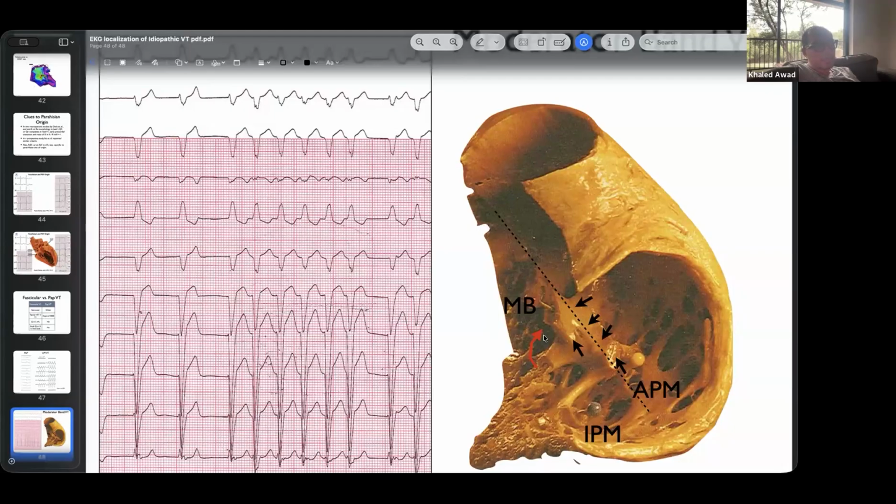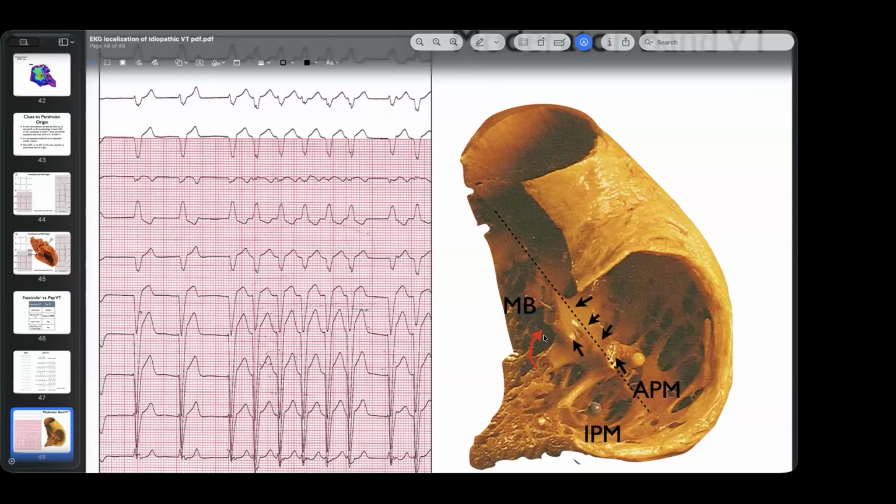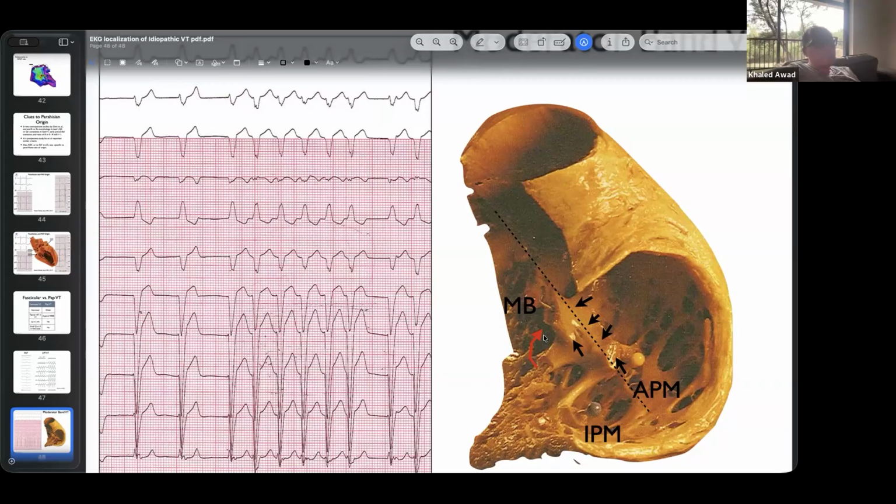I look at the signals and I look at the response I'm getting from tissue. If the PVC goes away, then I'm definitely staying here for 2, 3 minutes. If the PVC doesn't go away and the signal goes away, I know I'm not in the right spot, so I'm going to go somewhere else. If you stay 3 minutes in the same point, you will get a very high ablation index, right? Yeah, it'd be really high. That's why I don't even look at it.